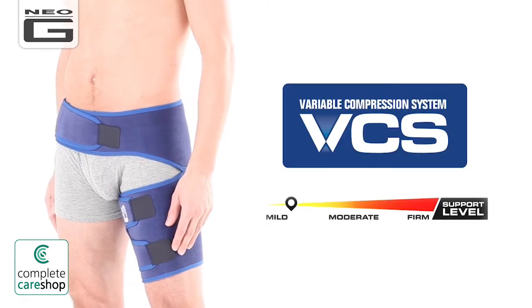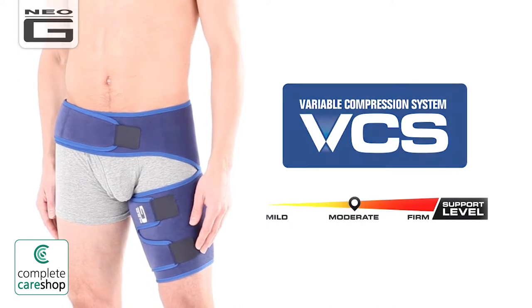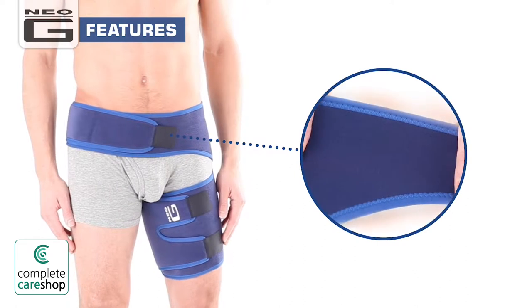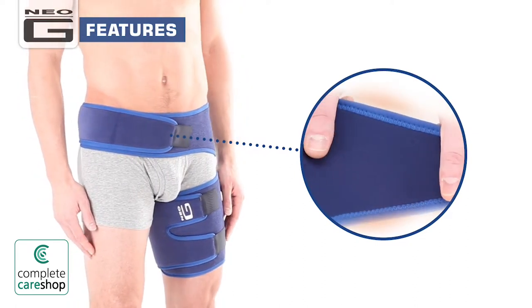The Neo-G groin support offers moderate support. The durable heat therapeutic neoprene helps warm the affected area, aiding with muscular aches, pains and stiffness.